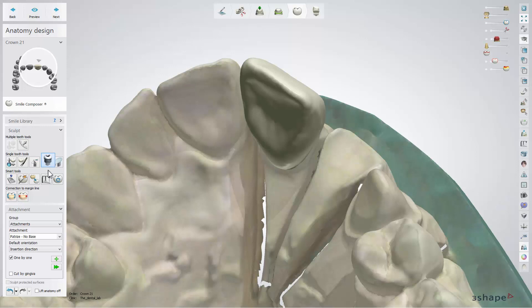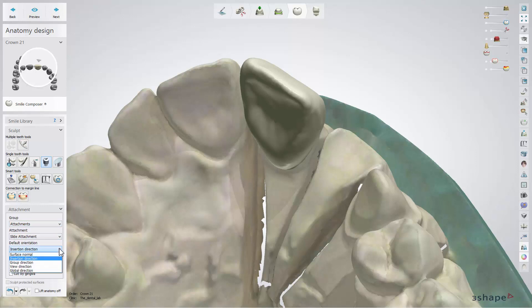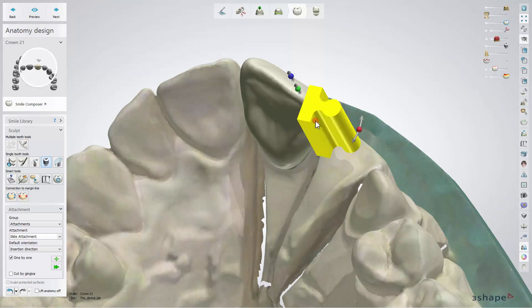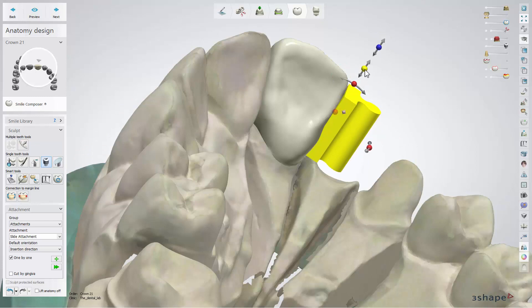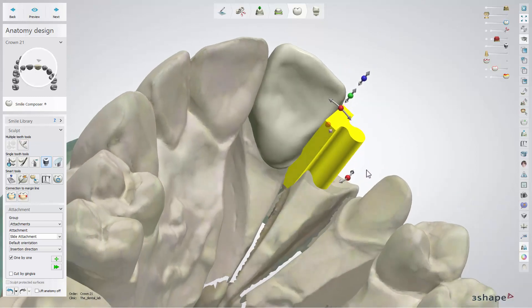The Attachment tool allows you to place an attachment on the restoration for any indication. In the attachment settings, you can select the group of an attachment and its type, as well as set the default orientation, for example the insertion direction or the view direction. The chosen attachment can be placed in the desired position and modified using the spheres. To add attachments one by one, just mark the checkbox, then add a new attachment by clicking on the restoration. You can also select the cut by gingiva option to have it cut to the gingiva.